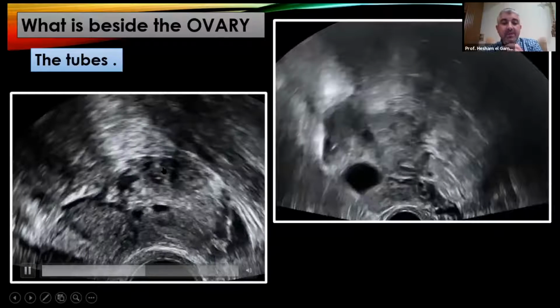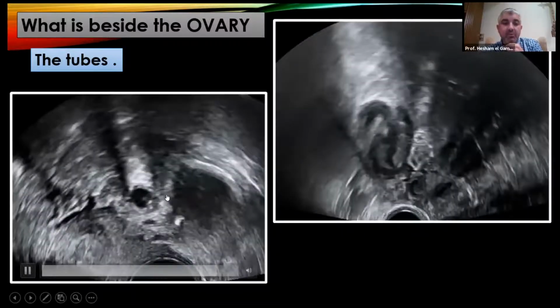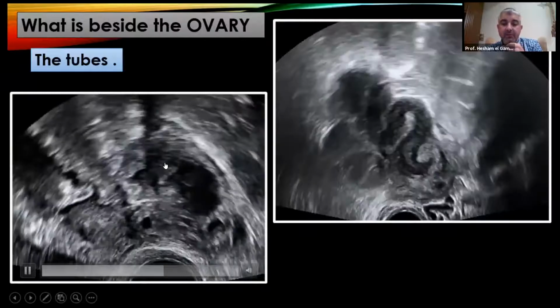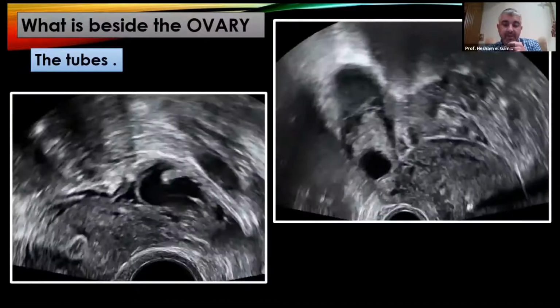And this is a very important tip with hydrosalpinx. When you see them opening, you see like cysts, and then when you move with the cyst, it opens and it unfolds into each other, indicating that this is actually a tube rather than a cyst.